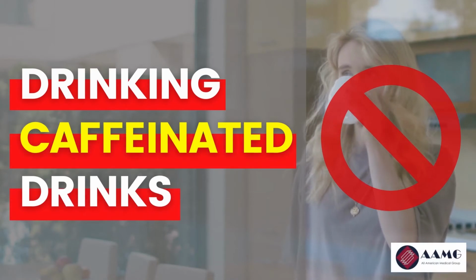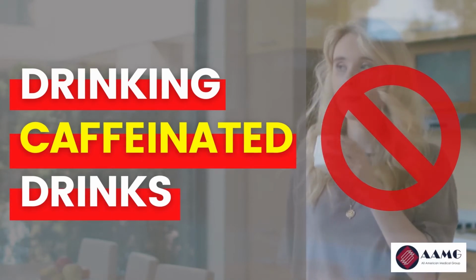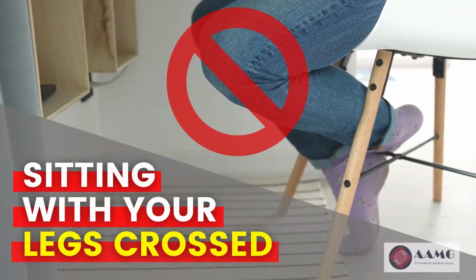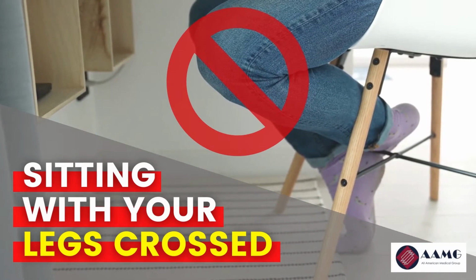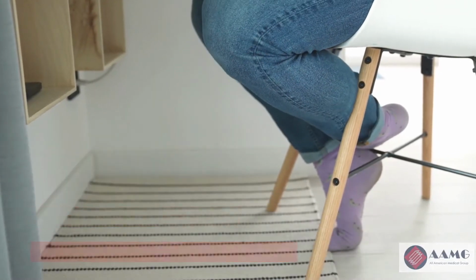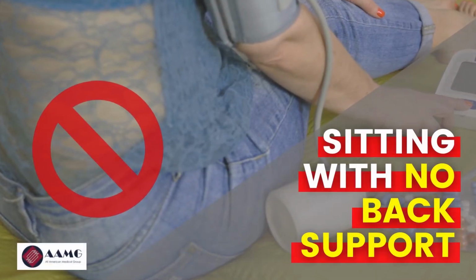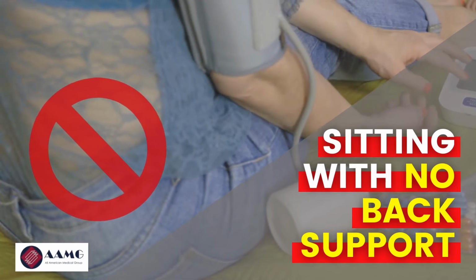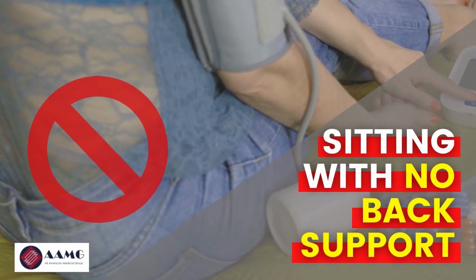Eating or drinking caffeinated liquids 30 minutes before taking your blood pressure. Sitting with your legs crossed and not having your feet flat onto the ground. Sitting in an uncomfortable chair with no back support and not waiting at least 5 to 6 minutes before taking your measurements.